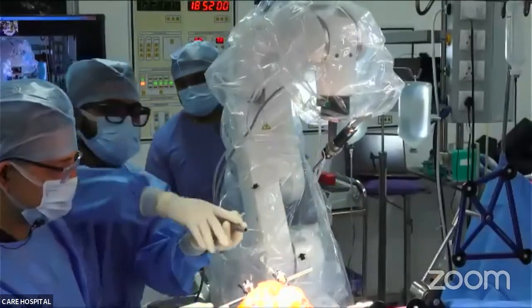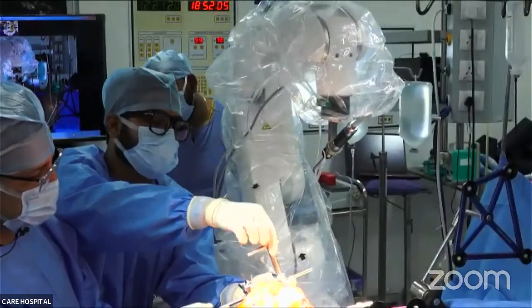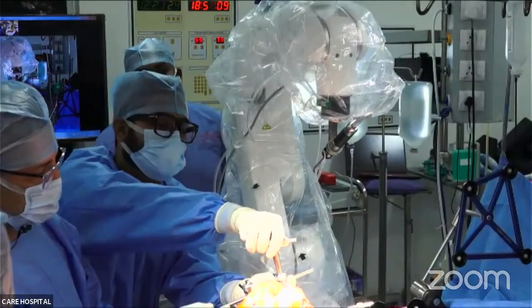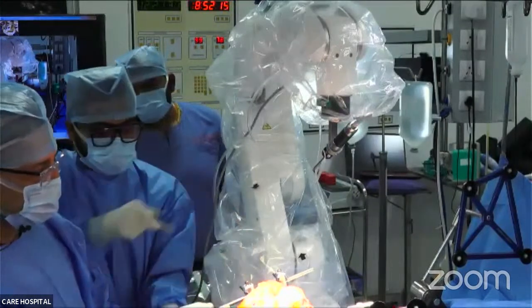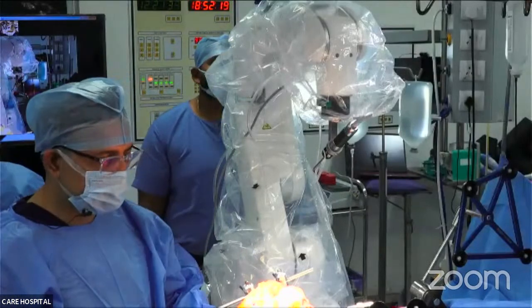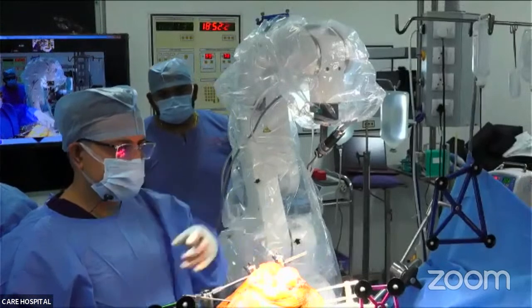Right. There are two additional equipments. One is a foot holder, like in the desired angle of flexion extension, you can hold the foot. And there is a distractor, which is applied in the posterior part of the distal femur, just to distract the femur away from the tibia when the burr will be cutting. So today we are not using the distractor, because there is enough gap and we think we can work without that.